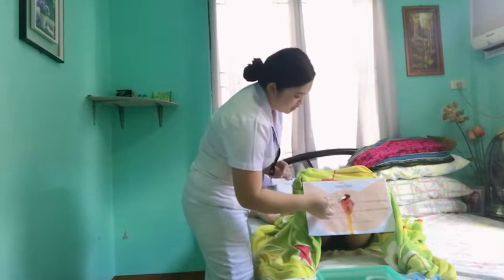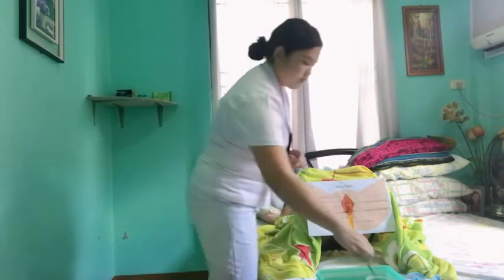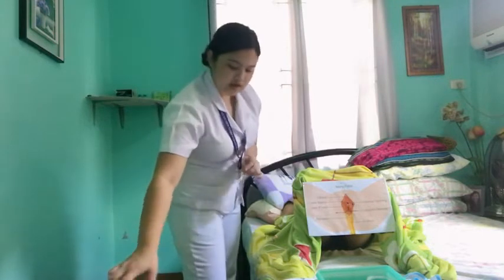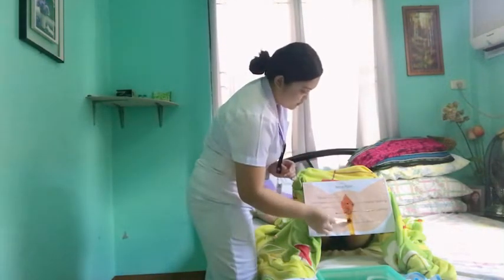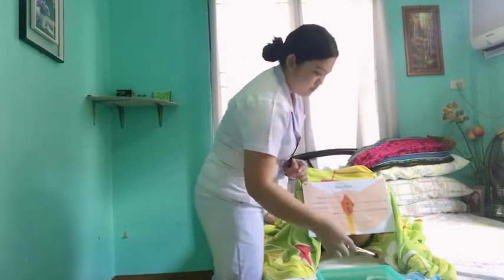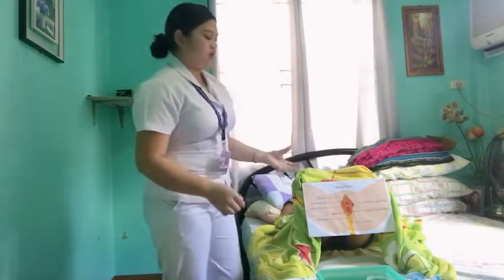Then from labia majora, do it on the other opposite side. Then labia minora, so never restroke the cotton ball.